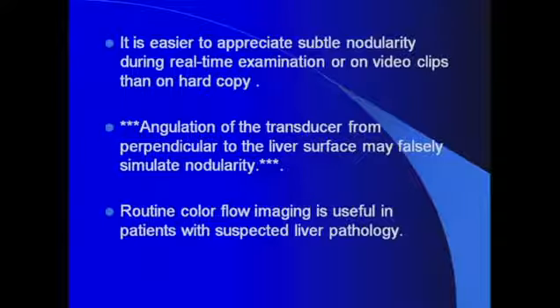In addition to that, you should always include color Doppler evaluation of all your patients suspected of liver pathology. This is very important. Even if most of the exams come to you for evaluation of patients with liver disease as right upper quadrant without Doppler, you really don't have to have a Doppler order by the clinicians, because most of the clinicians in practice, specifically primary care physicians, are not aware of specific Doppler study requests for their patients. So the most common exams and orders that are going to come your way are going to be about right upper quadrant.